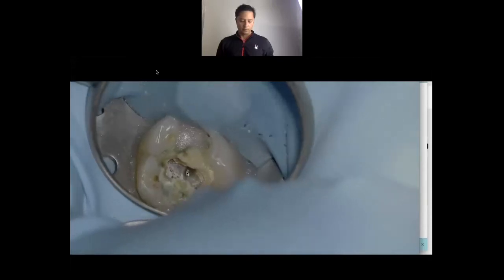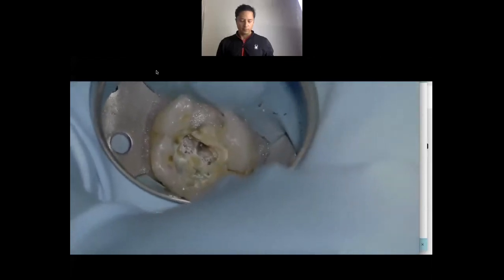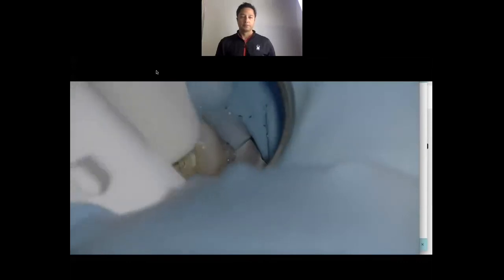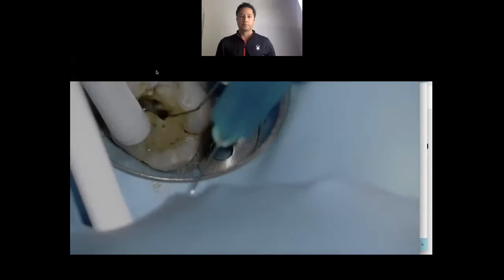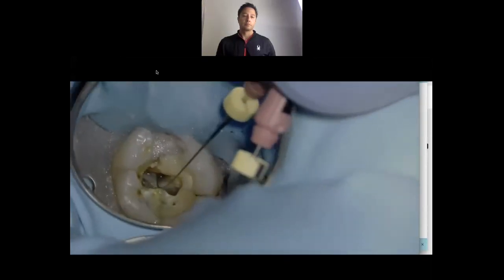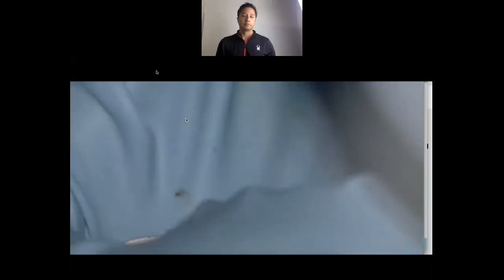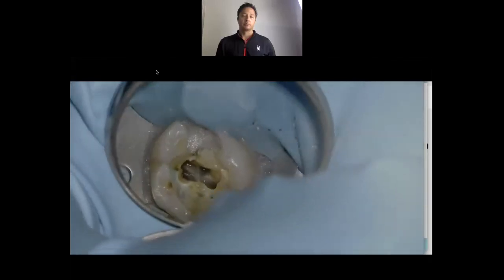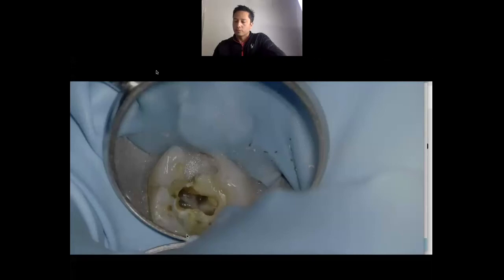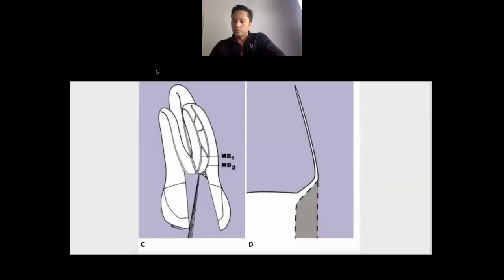I'm going to move that more mesially and let's see if we can get engagement with the six file. This case was a gimme — pretty simple because I felt the stick with the endo explorer. I'm going to take a six file — you can see the curve on it — and I'm trying to be a little more conservative. What happens is the file can come straight out the distal. This is the distal buccal, this is the palatal, this is MB1 and this is MB2. What I was doing with that Muntz bur is removing this little ledge, because the MB2 enters the pulp chamber at almost a 45-degree angle. We need to remove that ledge — otherwise the file hits the ledge and can't make that curve apically.